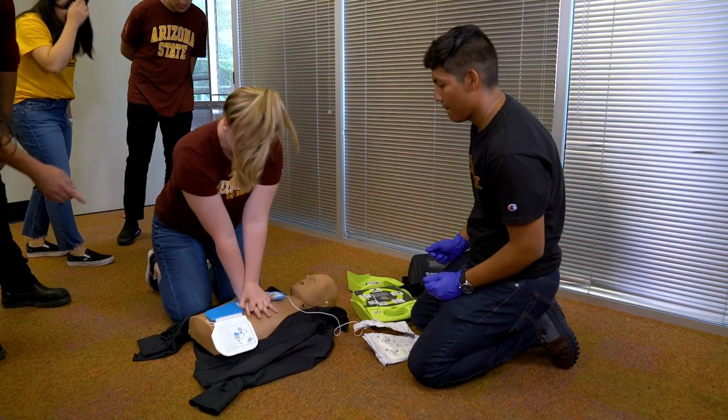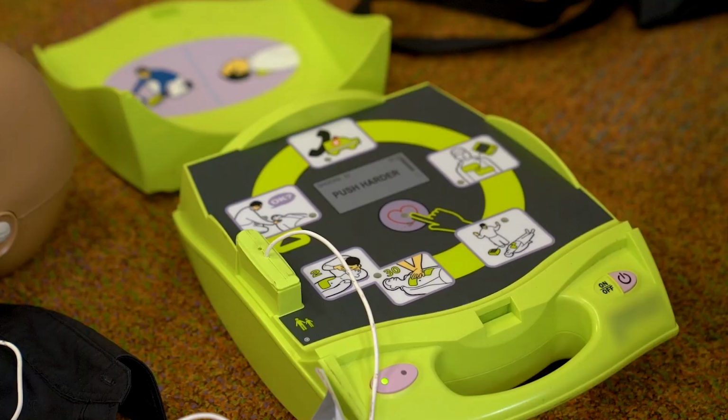Continue chest compressions until the AED instructs, "Don't touch patient." Analyzing. When the AED is analyzing, stop compressions and do not touch the patient. If the AED recommends a shock, make sure that no one, including you, is touching the person.